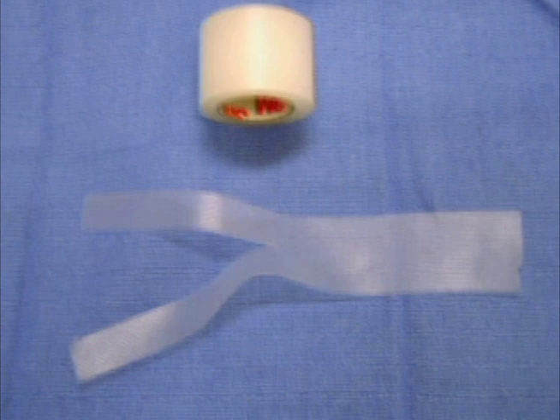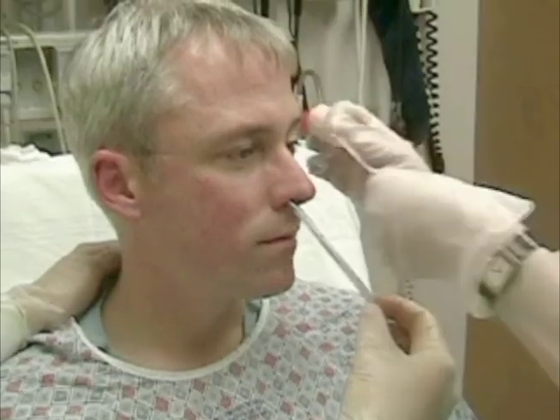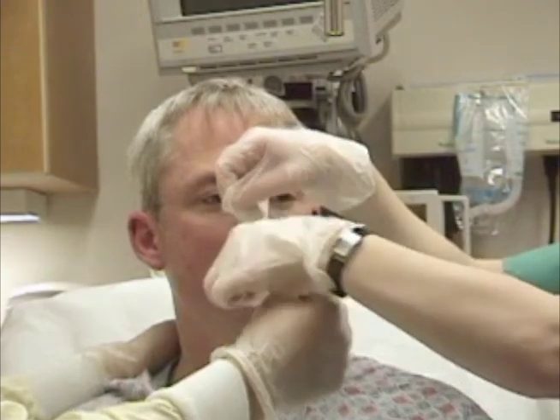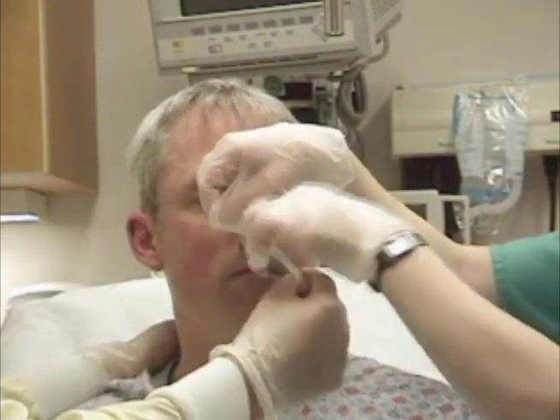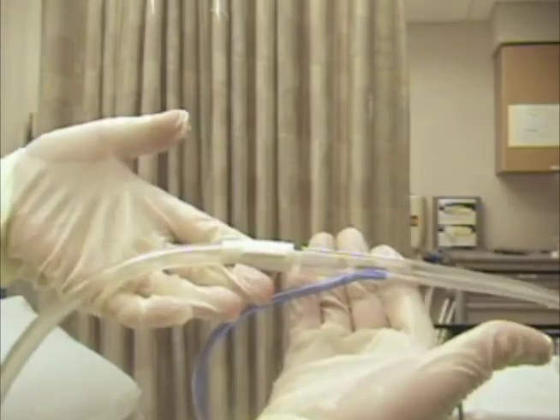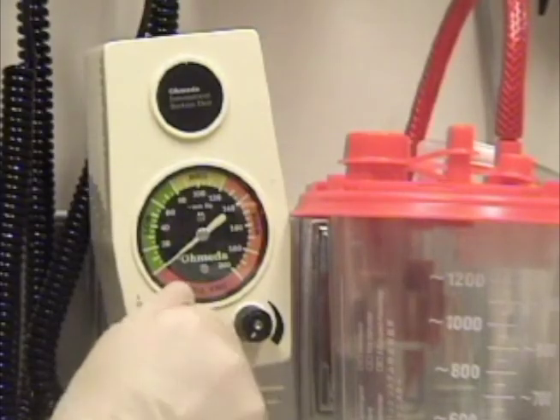Take a 5 to 7 centimeter strip of adhesive tape and tear it vertically for 1/2 of its length. The wide section is placed across the patient's nose, and the two tails are then wrapped in opposite directions around the NG tube. You may now connect the nasogastric tube to suction. Turn on the suction and adjust the vacuum force as desired.